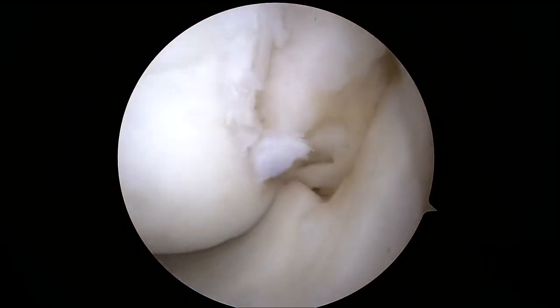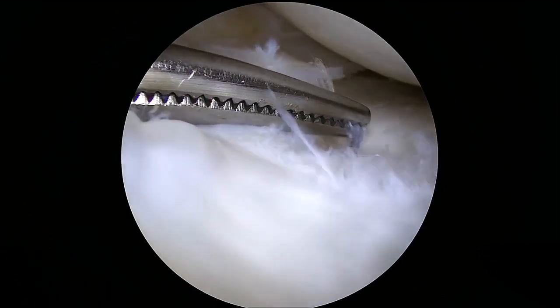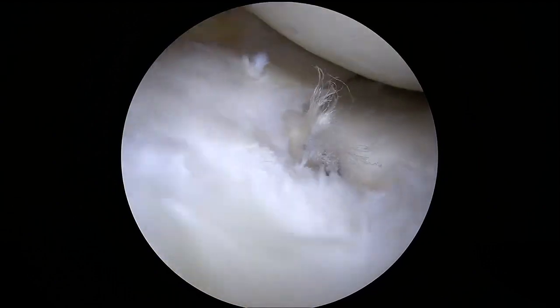Chondroplasty, synovectomy, or other meniscus repair may be performed at this time if necessary. The site of the previous medial meniscus root repair is examined to determine if the sutures remain in correct position, the severity of the tear, and the feasibility of revision.